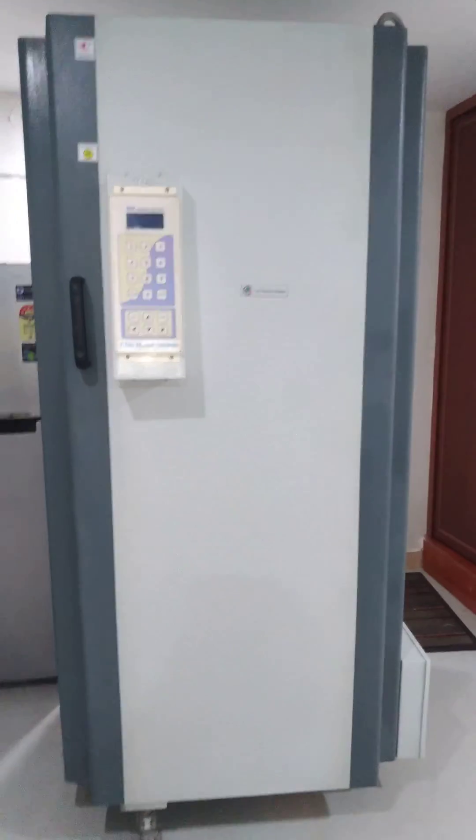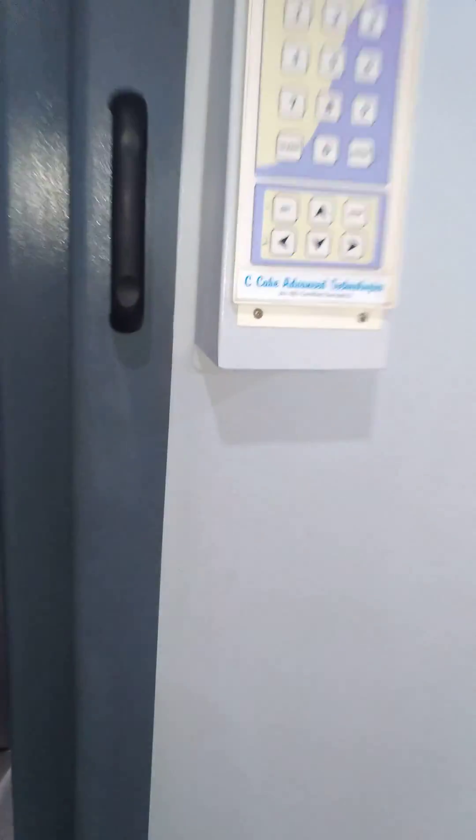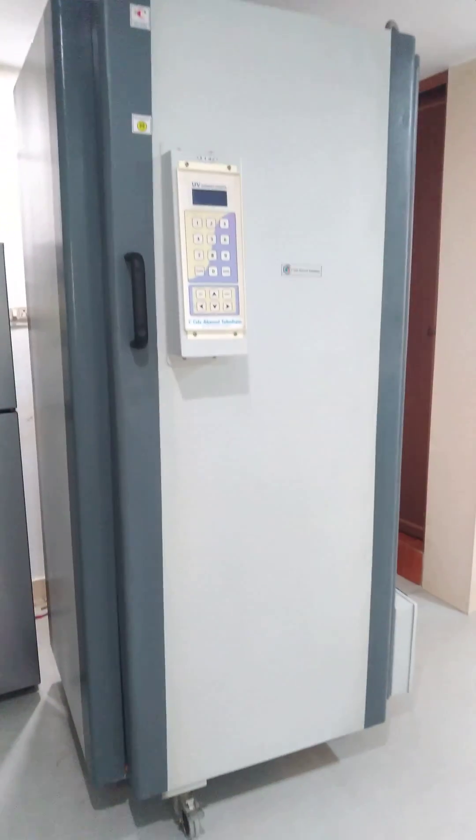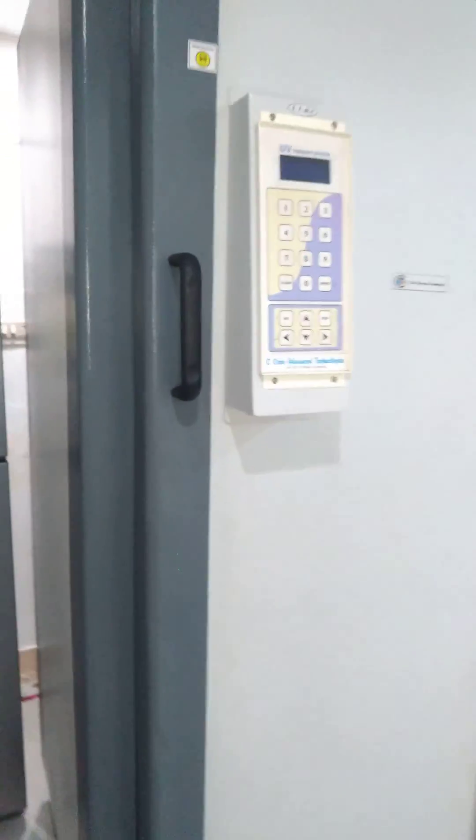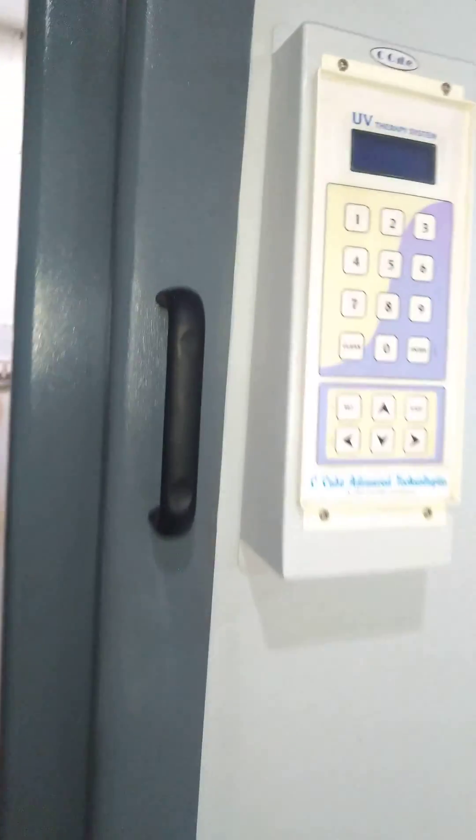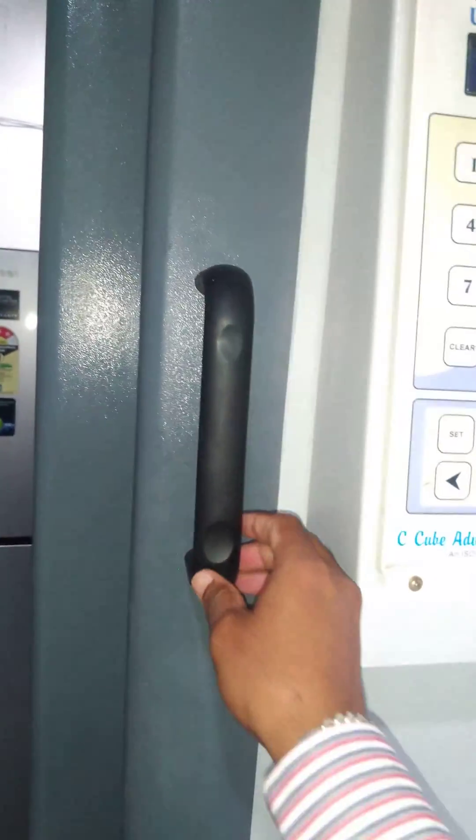This is a whole body UV therapy chamber manufactured by C-Cube Advanced Technologies. This unit is at Marathalli, Bangalore and was supplied in the year 2017, almost three years old now.